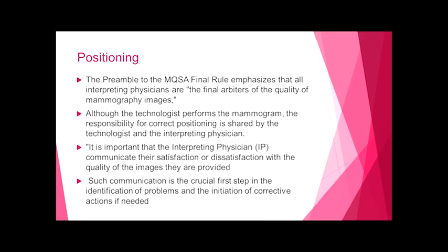This relates back to that team thing that we talked about, which was one of the original intents, that it would bring the technologist and the physician together to ultimately improve the quality of mammography. So it's important that the interpreting physician communicate their satisfaction or dissatisfaction with the quality of the images they are provided. And sometimes that's difficult to do.